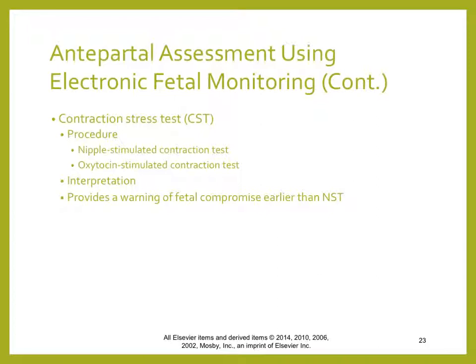If she does oxytocin stimulated, she is given a diluted solution of oxytocin, IV. There's some measurements in your book. Don't get hung up on the actual dose. Just know that it's diluted down. And when we are interpreting a CST, you can have a negative, positive, equivocal, suspicious, or unsatisfactory result.